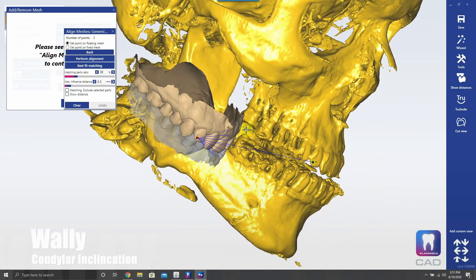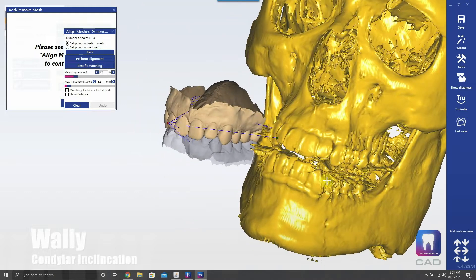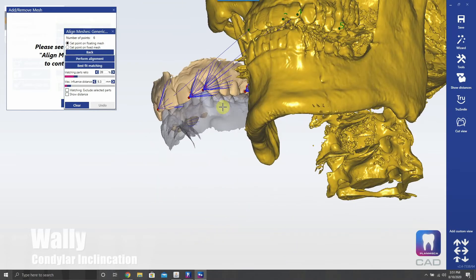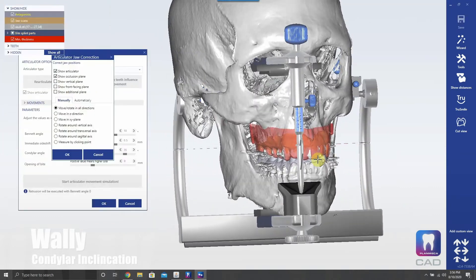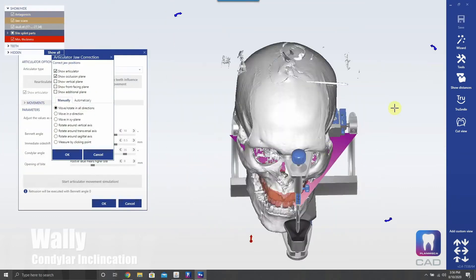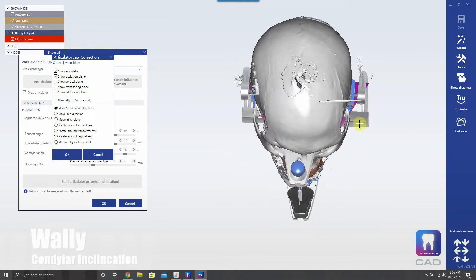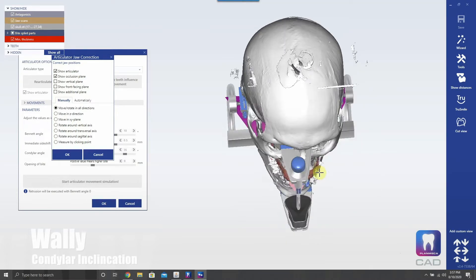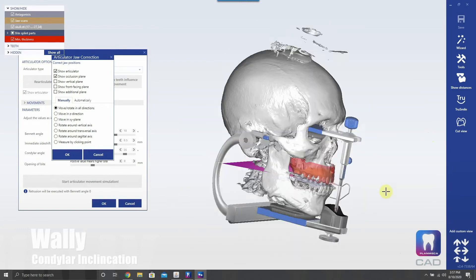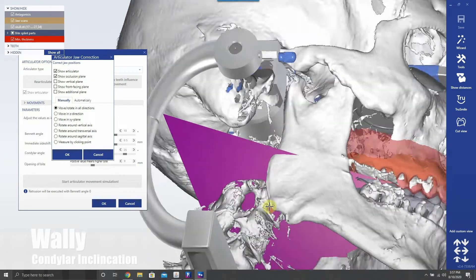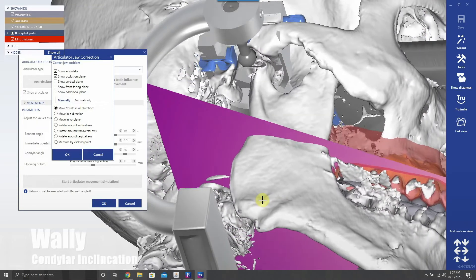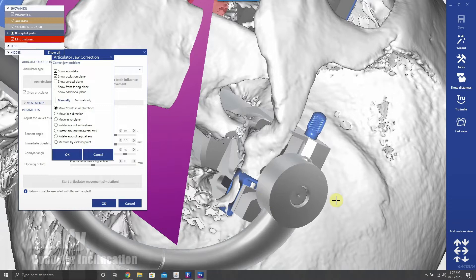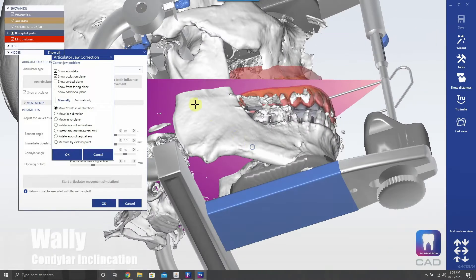Now I could have merged the models in Romexis — in fact, Romexis does a much better job at merging models to DICOM datasets than ExoCAD does, but I just forgot to do it. So I'm just merging the intraoral scans taken at MIP with the skull scan STL, and I'm virtually mounting it on the articulator so the articular eminence lines up with the rotation axis of the virtual articulator perfectly, giving us a proper mounting rather than using just averages.